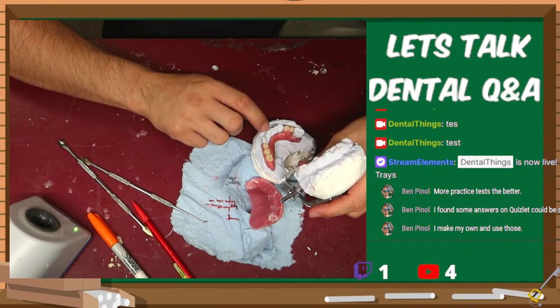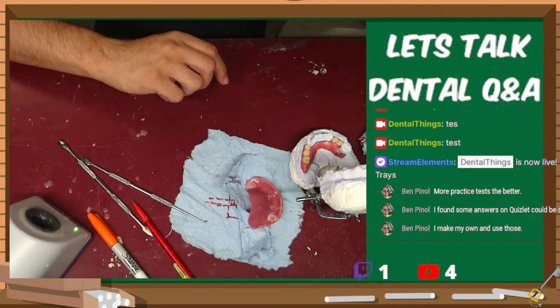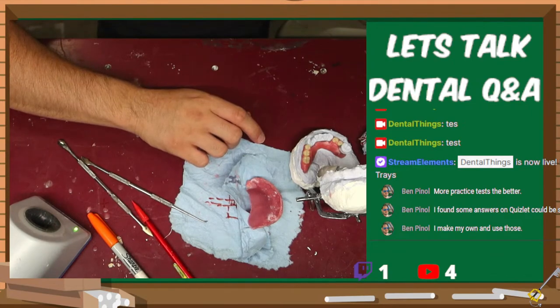I need to set a tooth for this lower tooth number 23. That's what I need to do. Let me go and switch this up just a little bit.